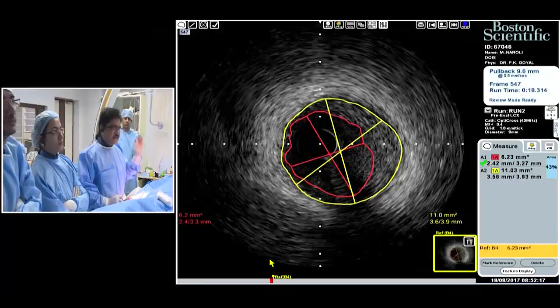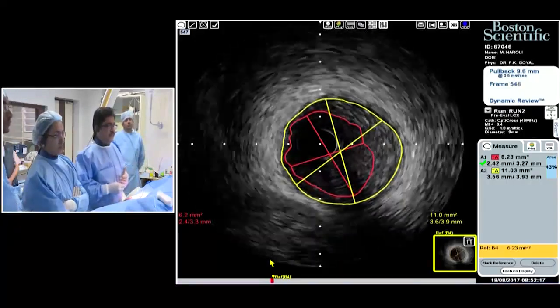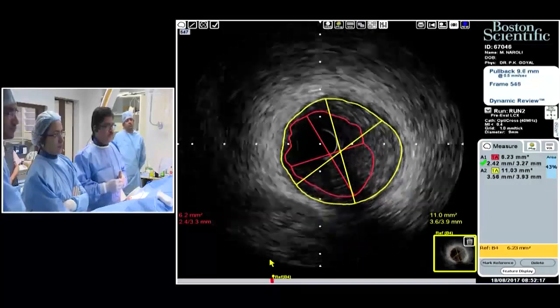Unless it's a pure ostial stenosis. I am asking about the ostium of left main. If it is free, anyway it will go into LAD here. But you generally cover the left main ostium if there is any distal disease also.